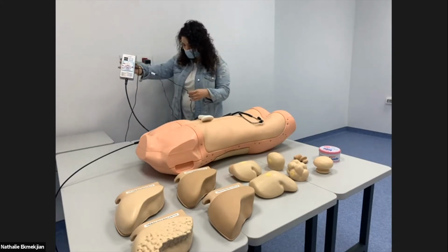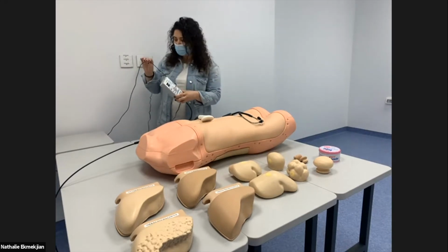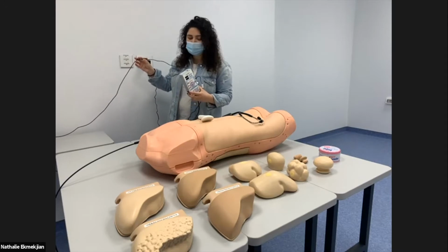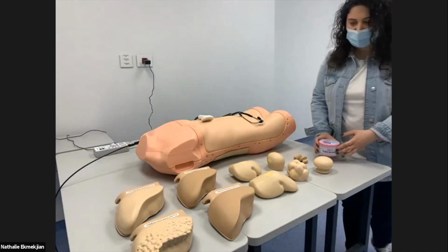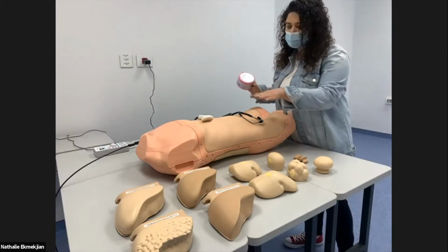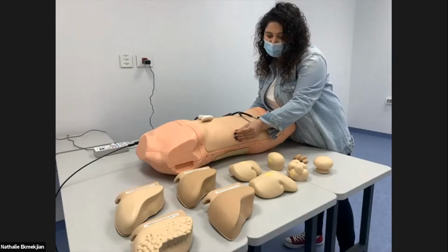The power, I have linked to it a speaker. It doesn't come with the set, but just for us to hear the auscultation sounds. It comes with the baby powder. Once we finish our exercise, we put baby powder in order for the skin to have this tactile feedback.